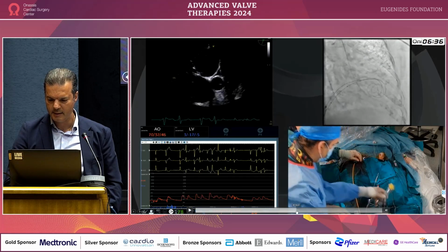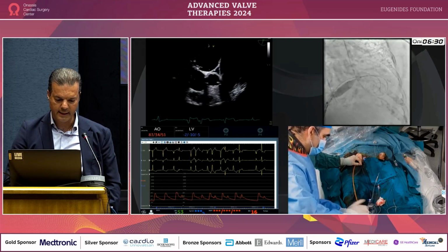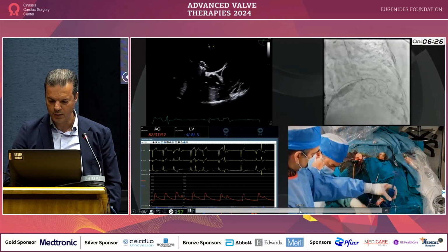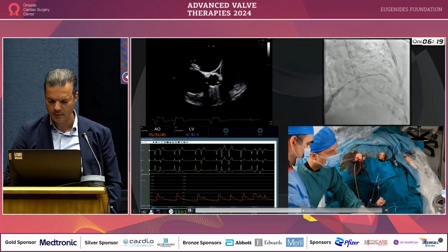Here is the septostomy, you can see. So blood pressure settled. I mean, it's about 80. It's not too bad. We didn't have to rush into some drastic measures on that. So balloon septostomy.